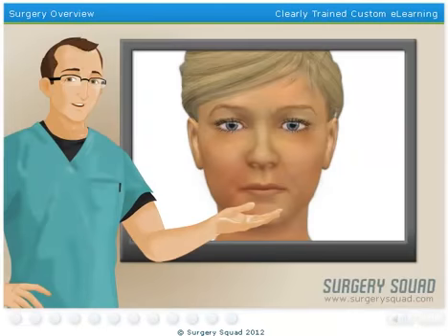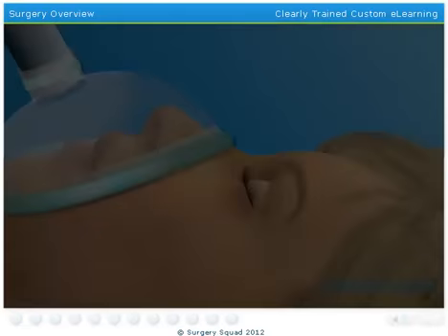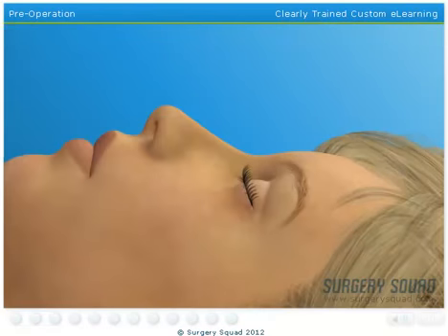Our patient is a female in her 20s that has been experiencing severe pain in her mid-abdomen, vomiting, and a mild fever. These are all common symptoms of appendicitis. Let's scrub in before this gets any worse. Our patient has already been prepped and is sedated, thanks to our dedicated nursing staff and anesthesiologist.